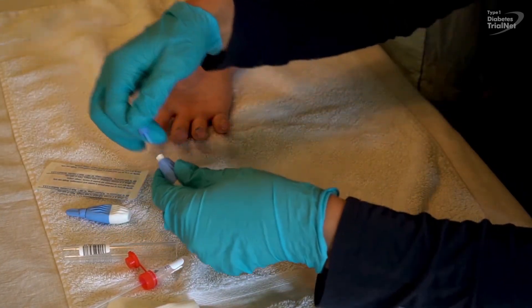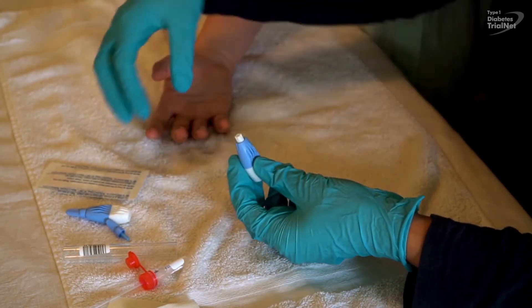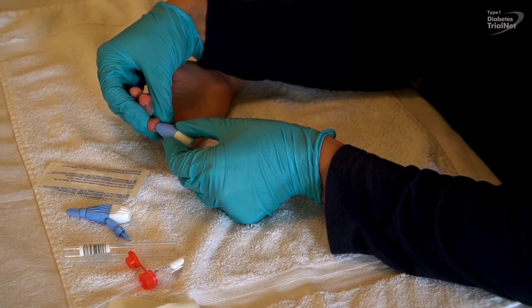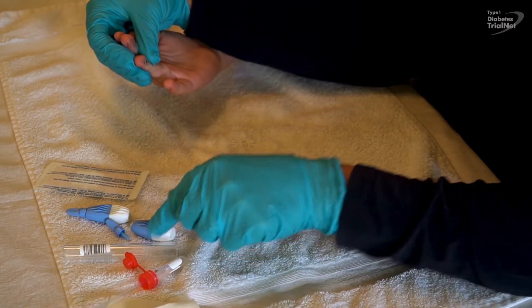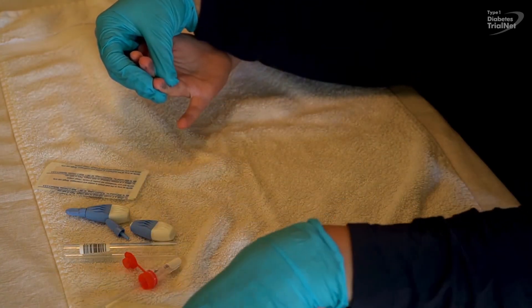Remove the tip of the sterile lancet. Place the lancet against the puncture site and press very firmly. This will automatically release the needle. Discard the first drop of blood by blotting on a gauze swab.